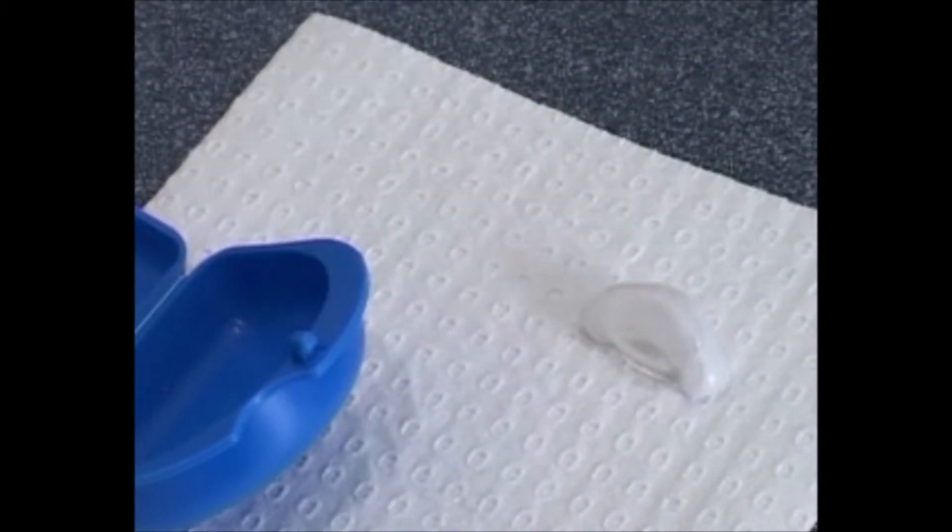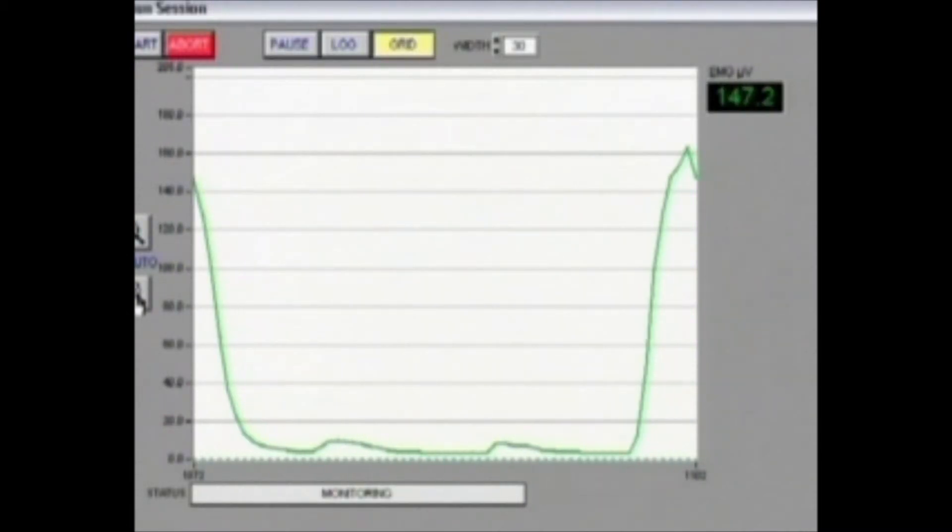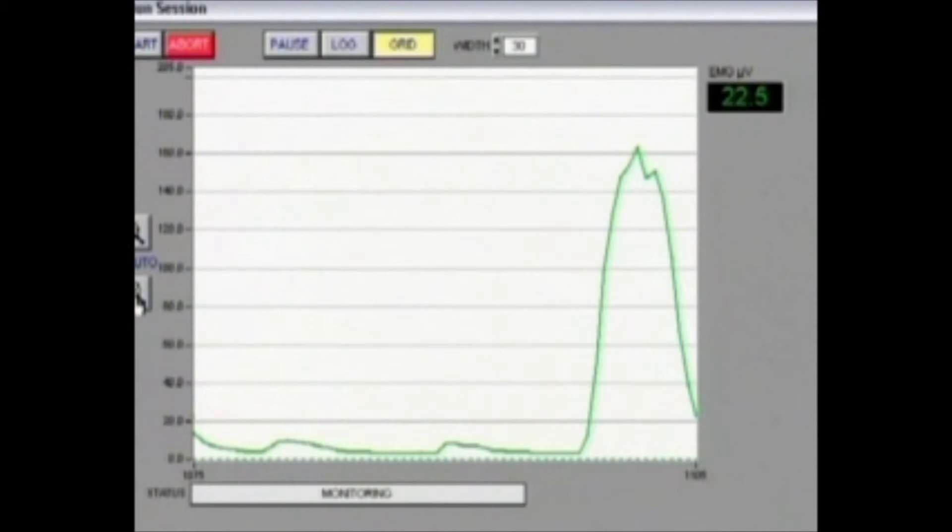It'd be interesting now to check the full mouth splint — this is the one Belinda has worn for about a year and a half. Clench as hard as you can on that splint, all the teeth touching. You can see Belinda's getting up to about a peak of just over 160, around 163. It's very interesting because we see time and time again that patients can clench even higher with a full mouth splint than with just an ordinary clench — so a full mouth splint is actually a good surface to clench and grind on.